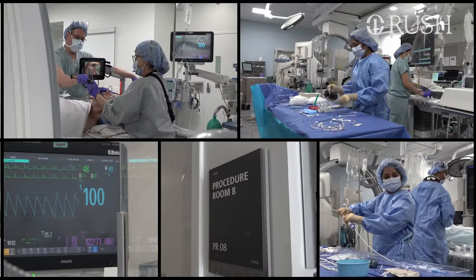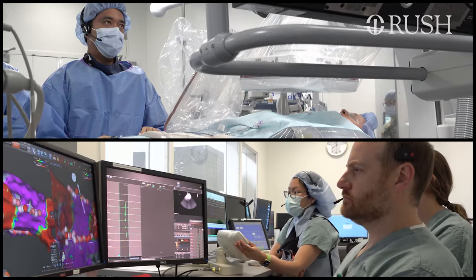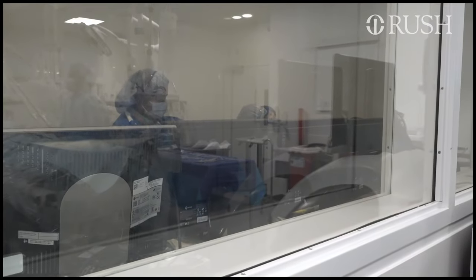Every ablation procedure requires team effort. Jamar and I are at the bedside, anesthesia's here along with our nurses, and we also communicate with our other staff and team members who are in the control room.